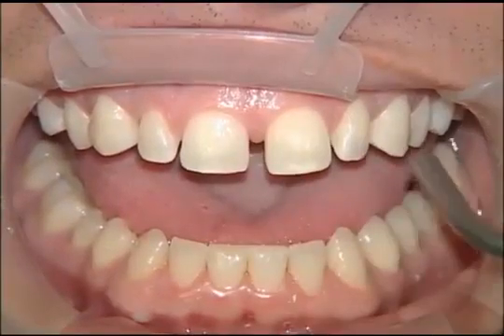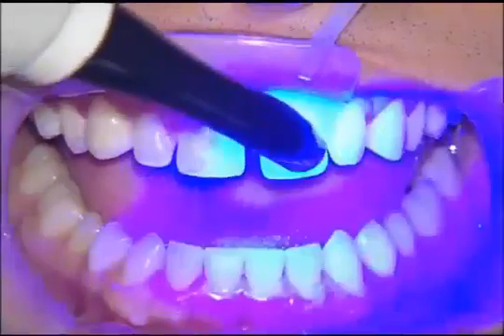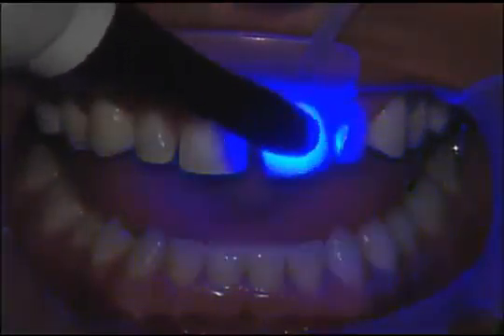This really isn't as big of a problem as it is with prep veneers, because there's nowhere in the preparation for it to pool and keep the veneer from seating. Once we've air thinned that pretty thin, we're going to go ahead and cure that.